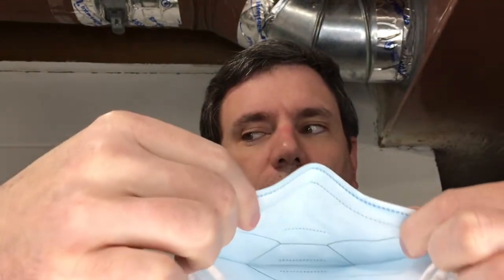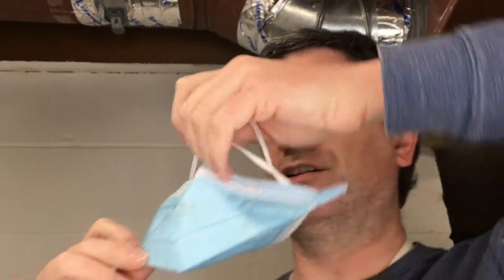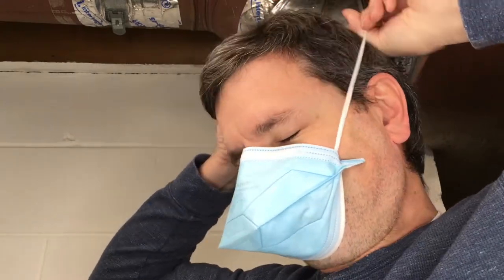I'm going to turn the camera around and fit this on my head so we can take a look. The mask is flat, but you want to curve the wire so your nose fits right in the middle. Then you put the bottom under your chin, pull the straps over your head and under your ears, then take one strap over your ears and on top of your head. Center it on your face and press the wire bridge down onto your nose to try and seal it.